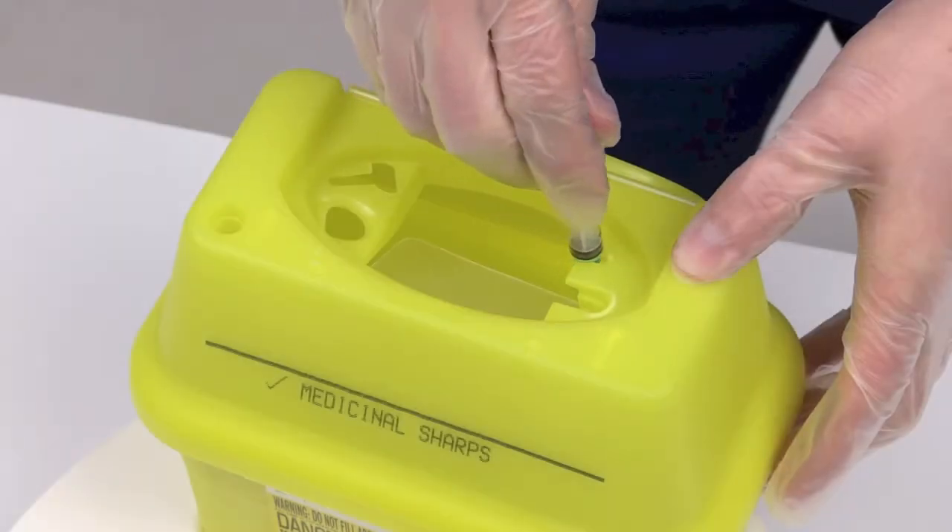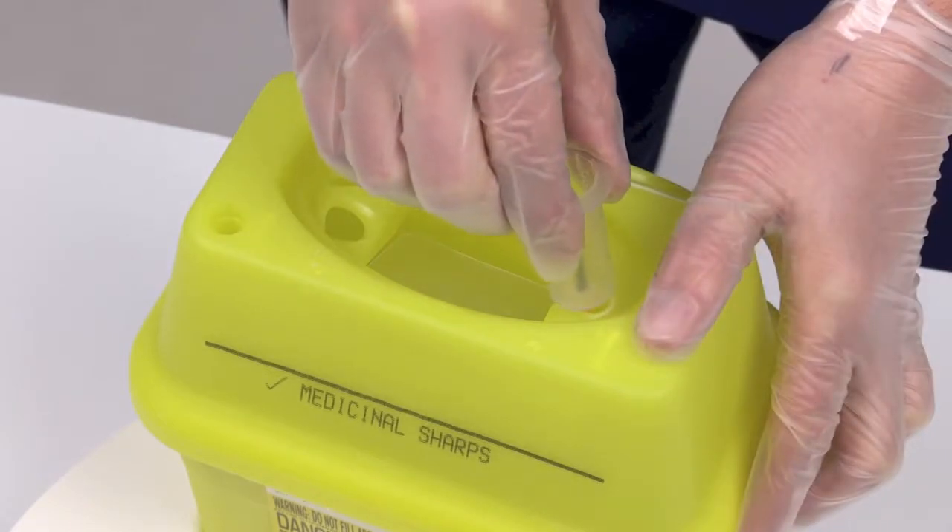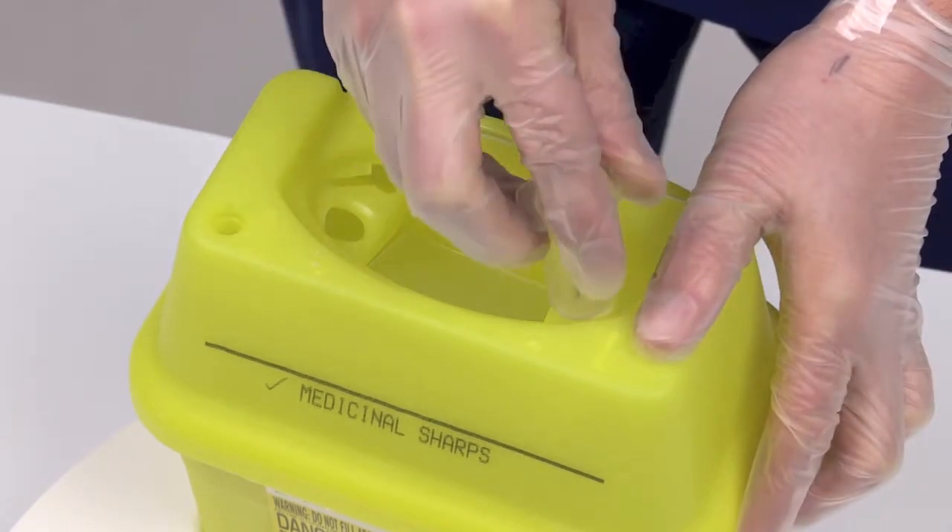If your protocol allows for the disconnection of sharps, you can separate the needle from the syringe by utilising the removal features on the SharpSafe container.